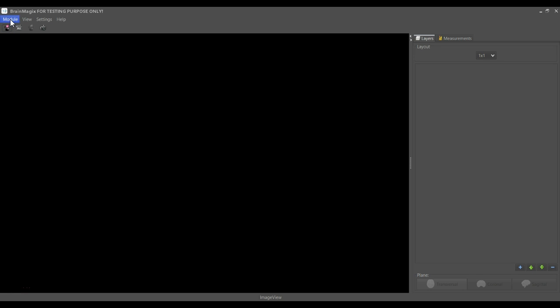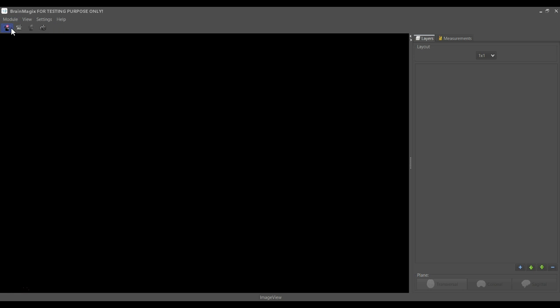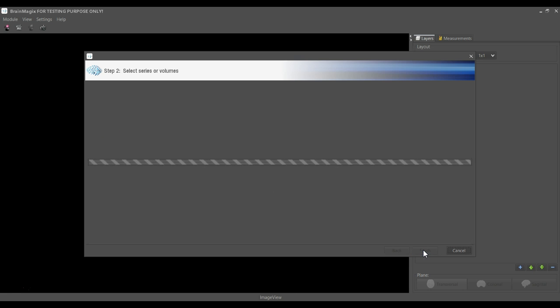We are in BrainMagix, ImageList Neuroimaging Software. We go to the Viewer module, which is the default one, and we load the examination, which is TD Tumor.